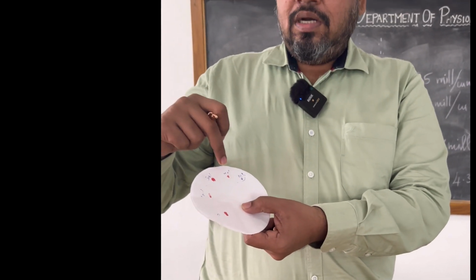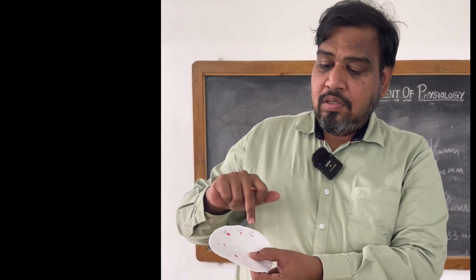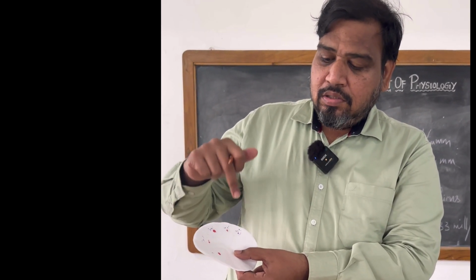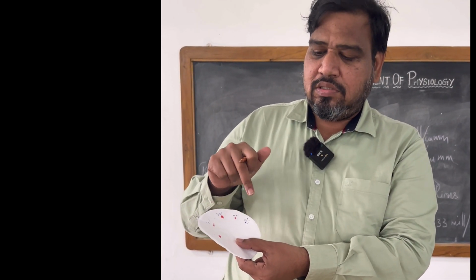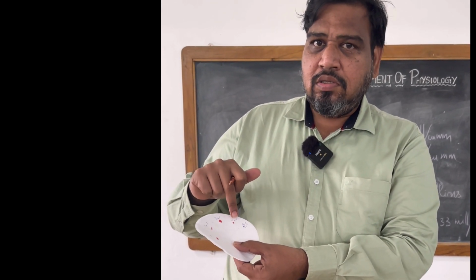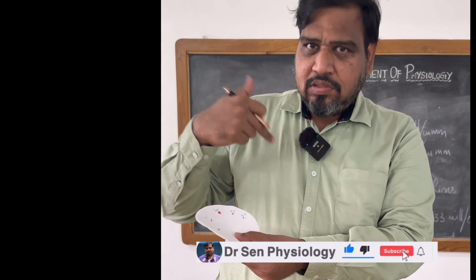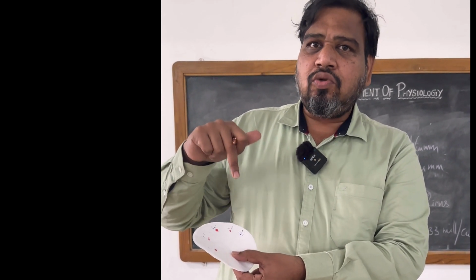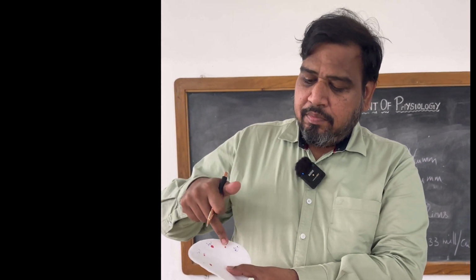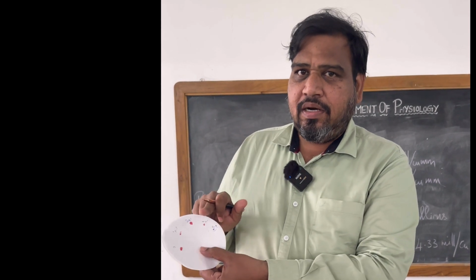Now the mistake which people commonly make is, everyone will tell bleeding time is 45 seconds, which is not correct, because still I have blood, I don't know whether blood stopped or not. But why am I marking it here with a pen? To show that there is no more blood or no more bleeding has occurred. So my bleeding time by Duke's method is 1 minute and not 45 seconds. The main aim is, you have to keep the blood drop until there is no blood. Some students say, sir, at 45 seconds the last blood drop is over, so the bleeding time is 45 seconds. No, because I don't know when the bleeding stopped. But at 60 seconds, bleeding stopped because there is no blood drop. So here the bleeding time is 60 seconds.